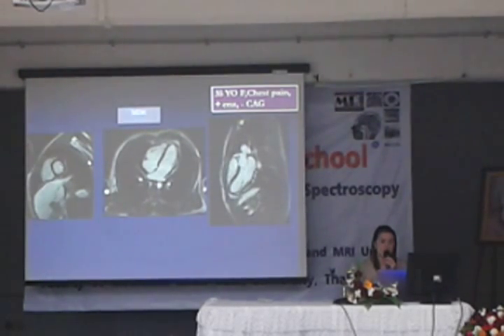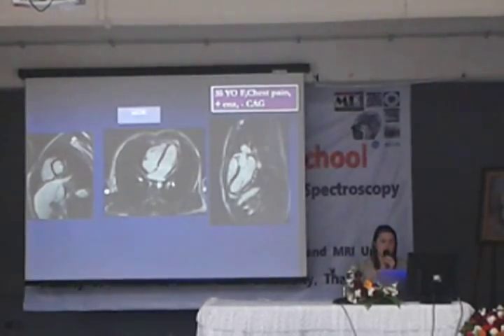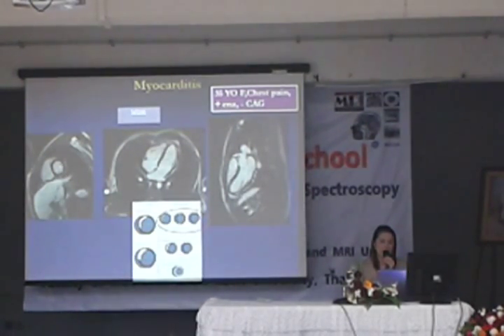And this is myocardial delayed enhancement, short axis, 4-chamber and 3-chamber views, showing patchy enhancement at the subepicardium. So we can give the diagnosis that she has myocarditis. The enhancement pattern, again, is different from an ischemic cause, right? It is subepicardial, which is enhancement at the outer wall of the ventricle.